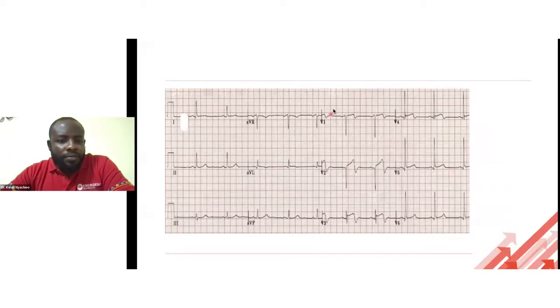I think it will be best if I give a clinical scenario. A 50-year-old gentleman has come in, not currently in chest pain. I repeat that, he's not currently in chest pain, but for the past 3 days, he's been having chest pain on and off, okay? So he gets these episodes of severe chest pain, he has to stop what he's doing, he has to rest, okay? Then it goes away. Then it comes back as a severe chest pain, okay?